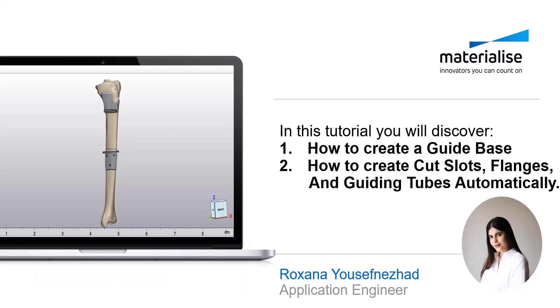In this tutorial, you will discover how to create a base, and how to use our automatic tools to create cut slots, flanges, and guiding tubes.